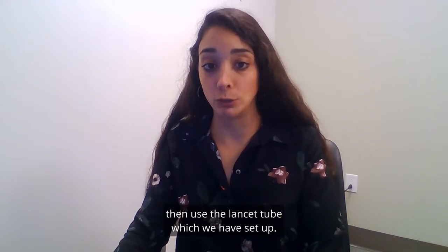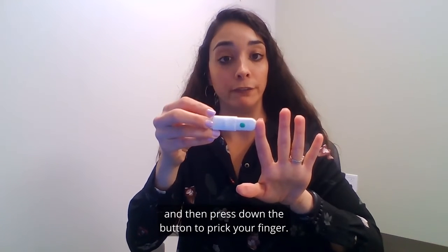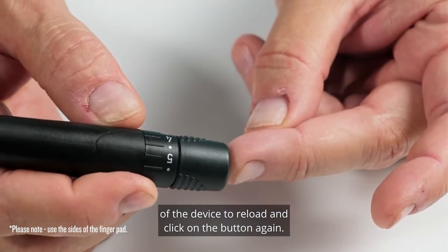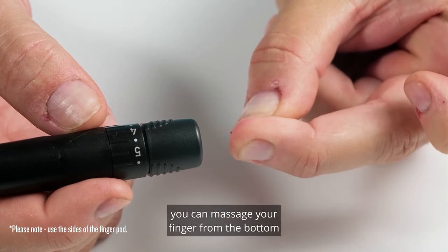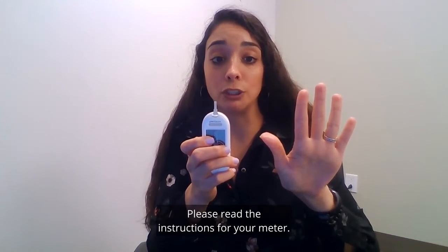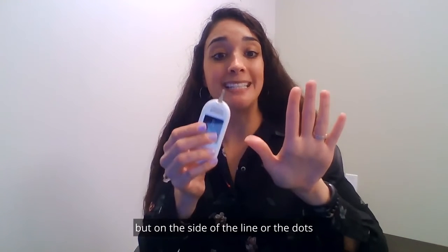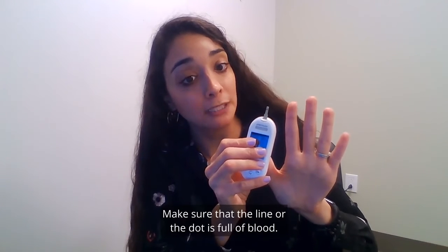Then use the lancing tool which we have set up. Put the tool flush against the finger and then press down the button to prick your finger. If nothing happens, pull on the back of the device to reload and click the button again. If you don't see anything, you can massage your finger from the bottom to the top until you see the drop of blood. Some strips need the blood drop on the front and some need the blood drop on the side — please read the instructions for your meter. Regardless of which one it is, you never put the blood on top but on the side of the line or the dots, which will absorb your drop of blood. Make sure that the line or the dot is full of blood.